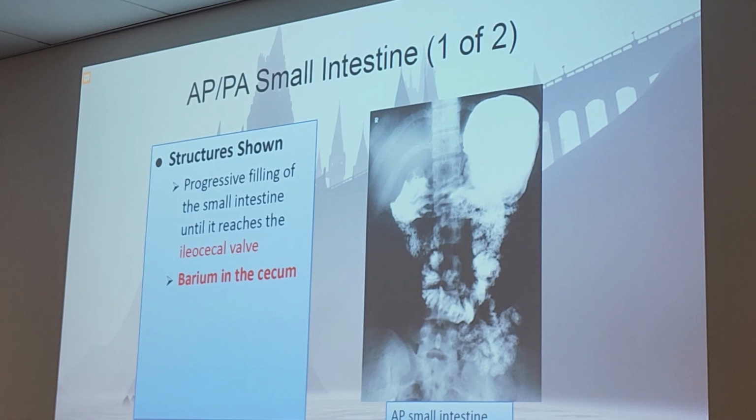So that would be an example right there on that picture of a 30-minute interval film. The reason I can tell that is look how high they're centered. We're not at the crest on that film. Either that or just a really bad tag on that picture. That's likely a 30-minute film. They didn't put a marker so you can't tell.